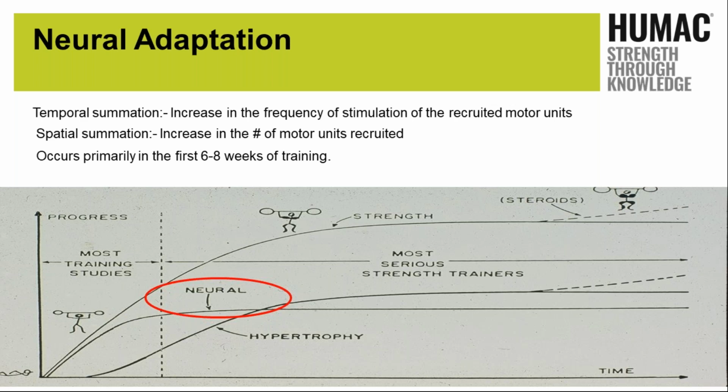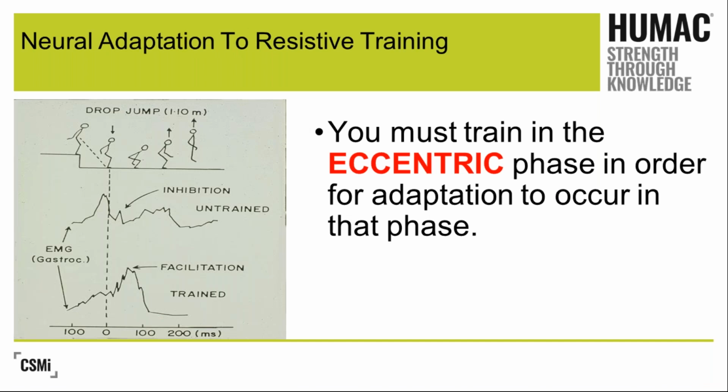And it's one of the largest points actually made against isokinetic exercise. Is it functional? So anytime we apply all of these principles in muscle rehabilitation, we can create very effective training and testing programs across the board. And again, we have to train in the phase that we want adaptation to occur.